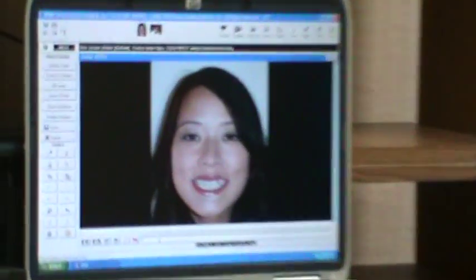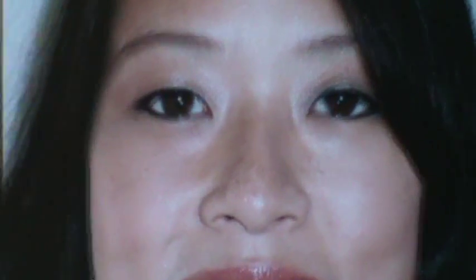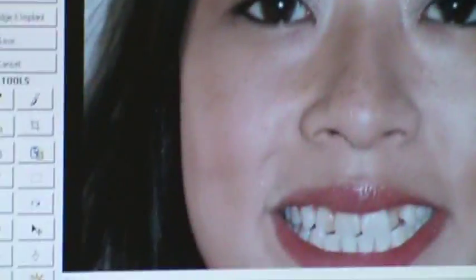What we start off doing when we do the simulation is that we take a photo of the patient and we enter it into the computer. Then we use specialized software to manipulate the image and give them the simulation. So I'm going to demonstrate that for you now.